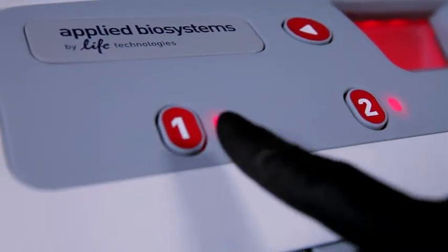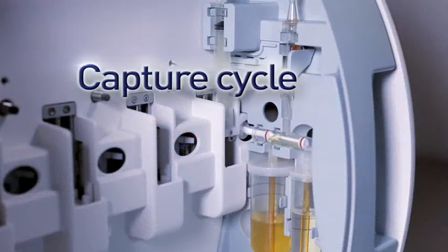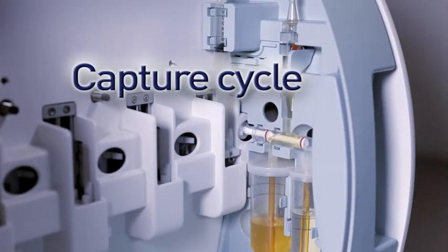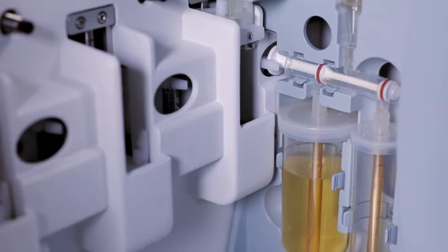When you're ready to start a run, just push the numbered button directly above the cartridge. During capture, the sample will cycle through the antibody-coated Pathatrix Auto Beads, which are held in the capture chamber by magnets. At regular intervals, the liquid will be expelled from the capture chamber back into the sample tube. This allows the sample to be mixed thoroughly.